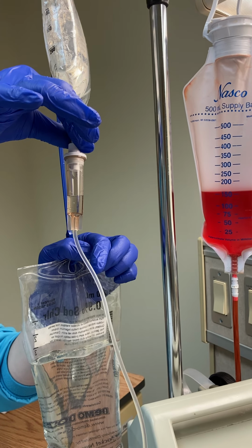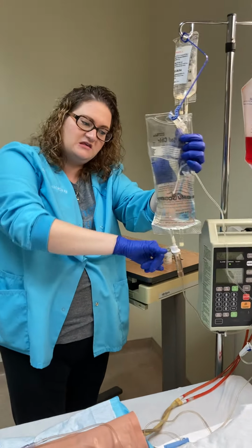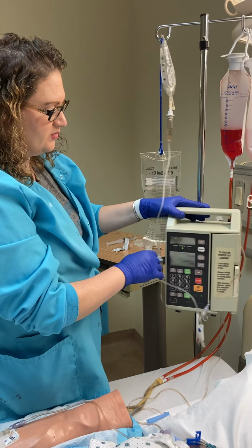And this will continue until they get there, until whatever's programmed in there runs out. Then, once it's done, the primary bag will resume dripping automatically by itself, as long as you've got your pump programmed.